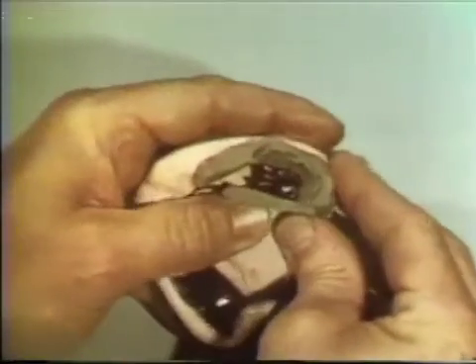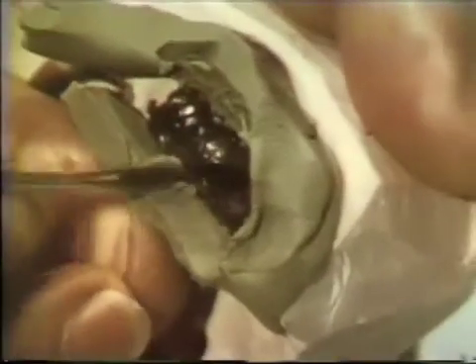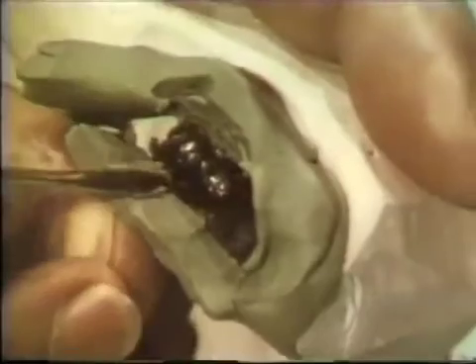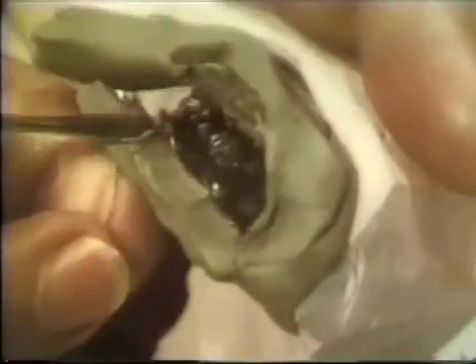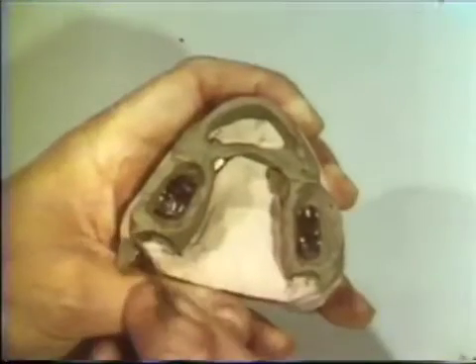Artificial stone will be placed into this box pattern to form the occluding template against which the replacement teeth will be set. The investing clay is formed to the peripheral borders of the wax pattern, and appropriate occlusal stops are provided on the stone cast.